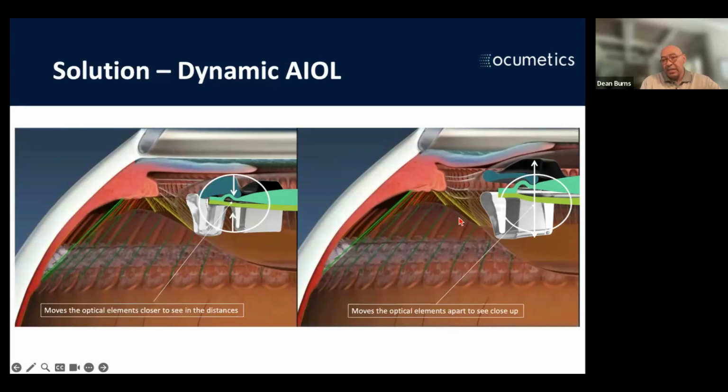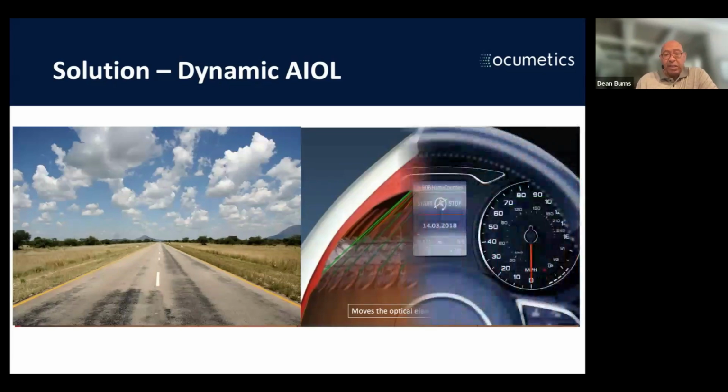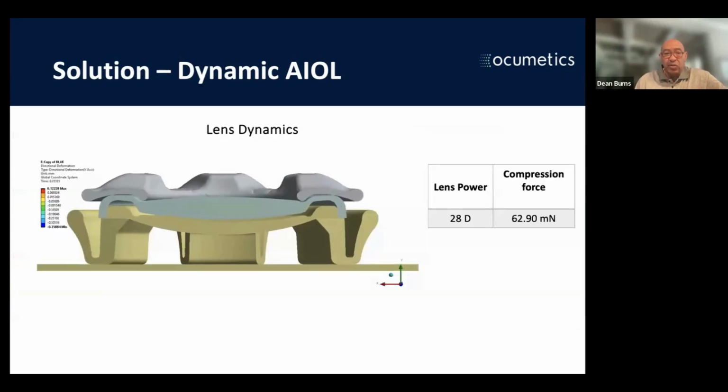When the eye relaxes and the lenses separate, that's where we get our accommodative profile and anything in between as well. Well, what does that do? We know the distance is going to be nice and clear, and it's going to allow us to see into infinity. And when we're using our mid-range vision or even looking at our cell phones up close, that vision is going to be really clear as well, because we're using the normal biomechanics of the eye, working with the ciliary process to actually do that.